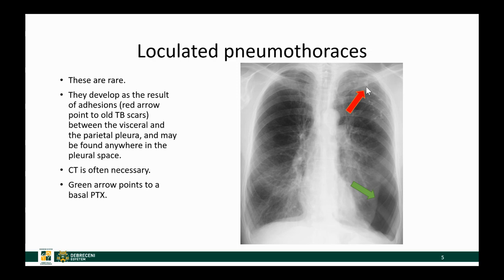Here is a case of a patient who has had TB, which is obvious from these calcified nodules and fibrotic tissue in the upper third of his left lung. You can see that the white line of the pneumothorax beyond which there are no lung markings is not visible above a certain level, due to scar tissue which doesn't allow the pleura to separate. If you're not sure, you can always get an expiratory image or a CT.